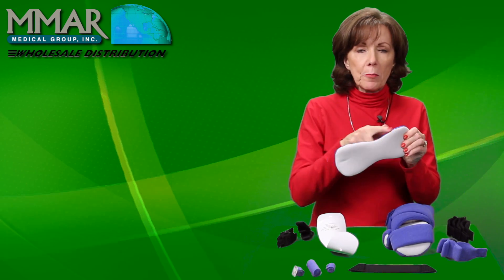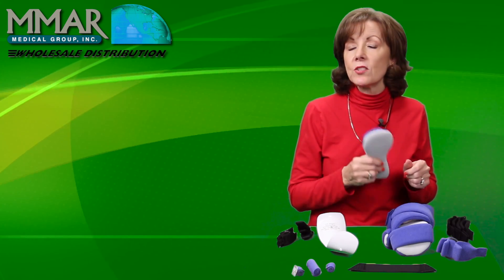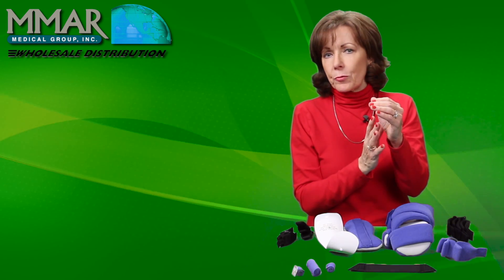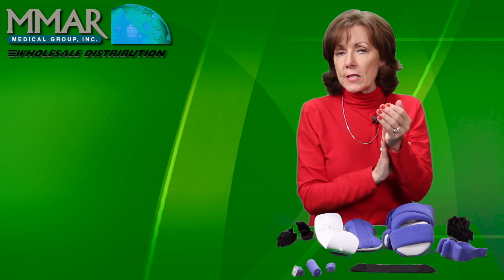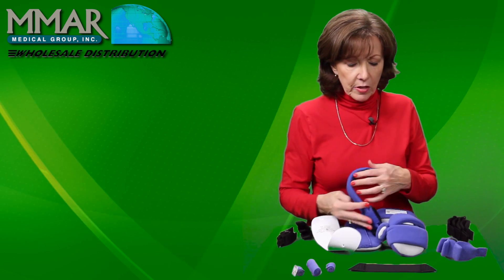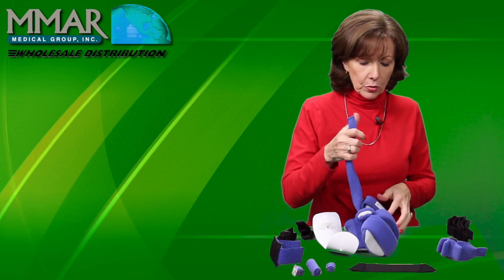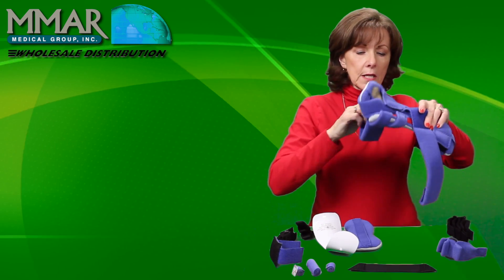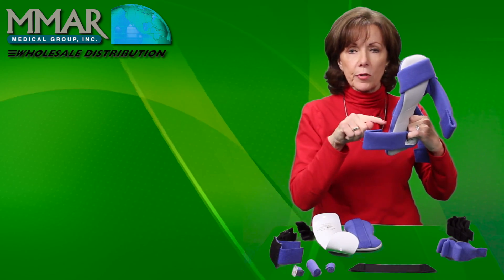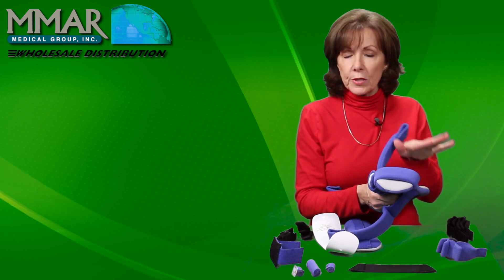This is called the infinity — it's shaped like an infinity sign, like a figure eight — and you can use it with any of our hand splints. It makes whichever hand splint you use it with into a dorsal hand splint. Our patients don't tolerate a typical dorsal hand with straps underneath; that can cause swelling, skin breakdown, and decreased circulation. So we add this infinity to the base of any of the regular hand splints. Make sure your straps are long enough to go over it — if the patient has swelling, we may need to send strap extenders. A Flex Technology splint will often help decrease swelling or edema.